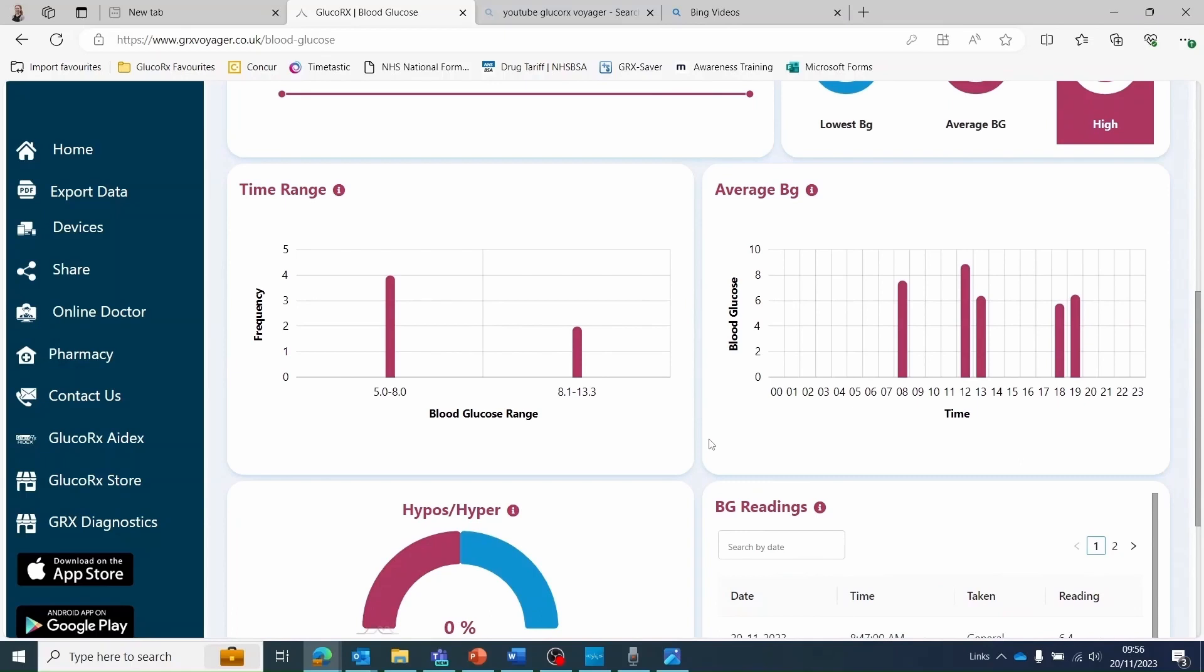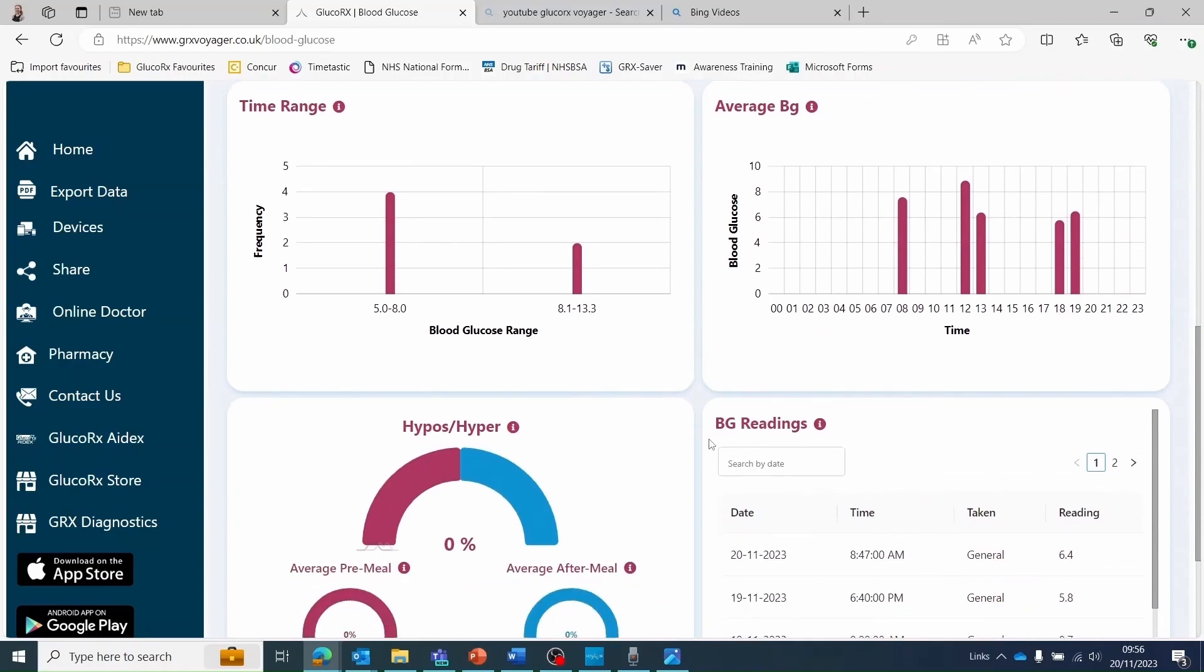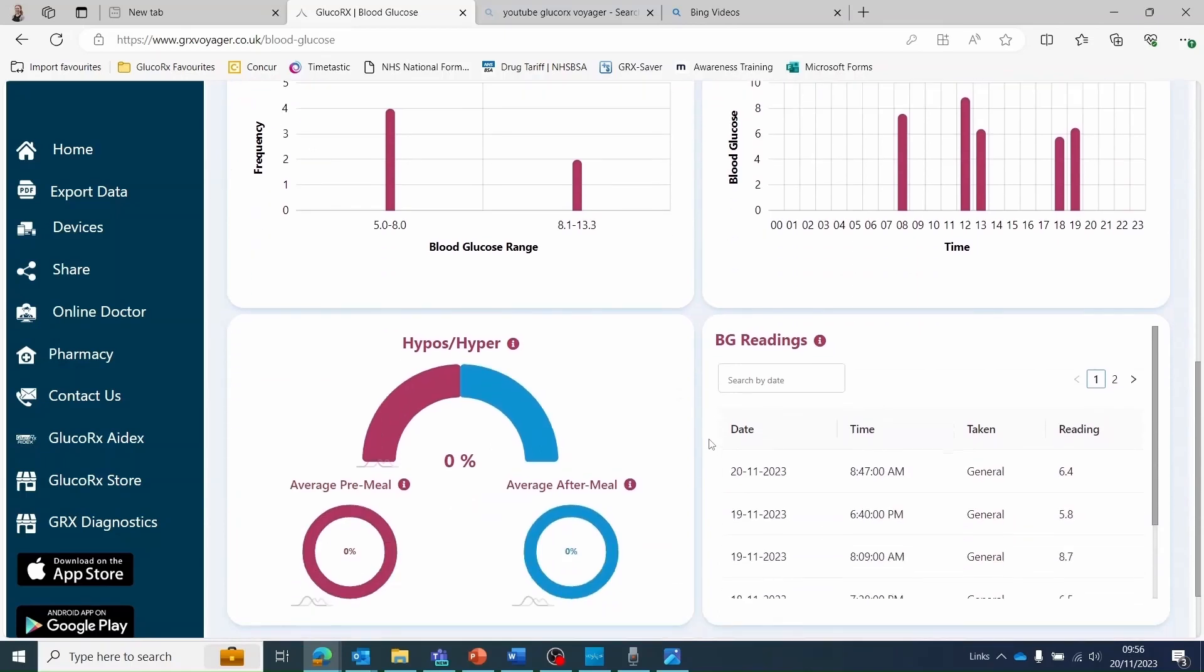The hypo hyper section will demonstrate the percentage of events you have recorded.